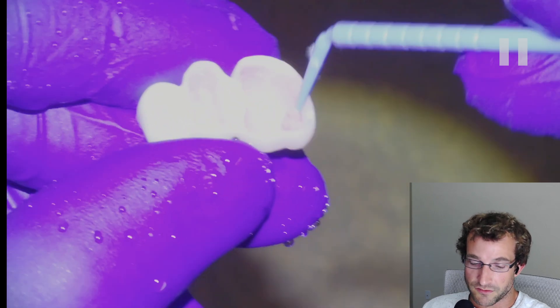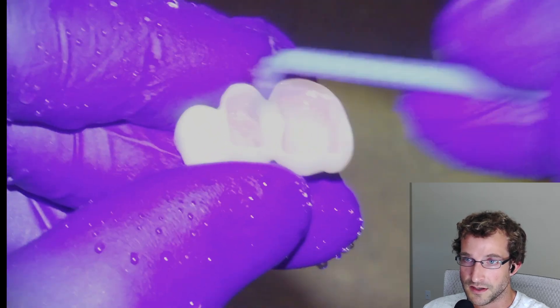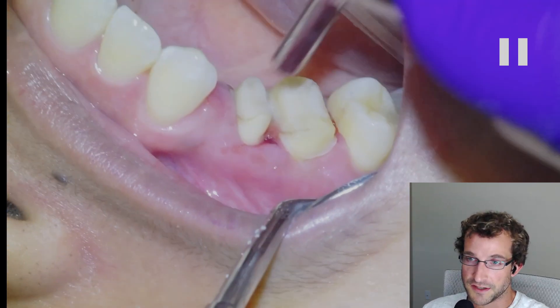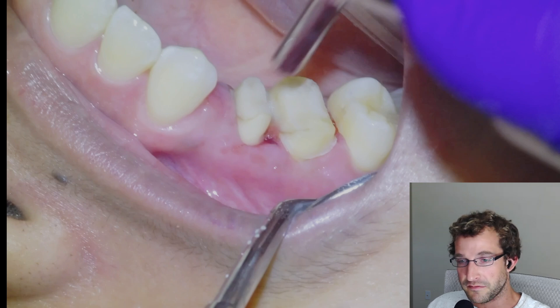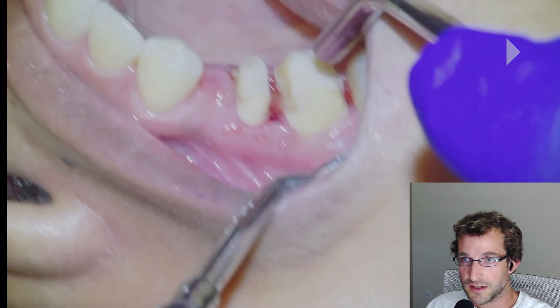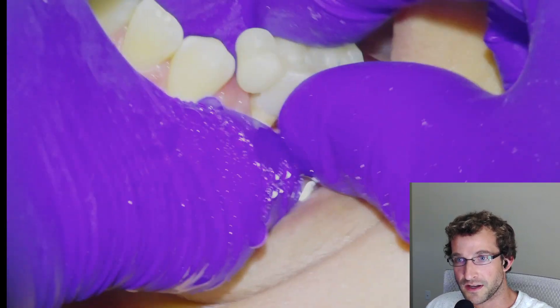Once we're ready to insert, we'll rinse and dry the bridge and put on some IvoClean on the intaglio surface, then rinse and dry that. Pumice the teeth, and as a final step I'll usually put a little bit of isopropyl alcohol on the interior surface of the bridge right before applying resin cement. So we're going to dry them off. I put a little piece of floss in between — I just wanted to try this to see if it would work to clear the cement from between the bridge teeth.